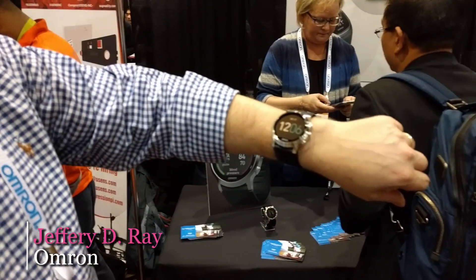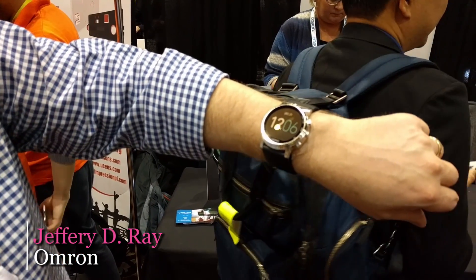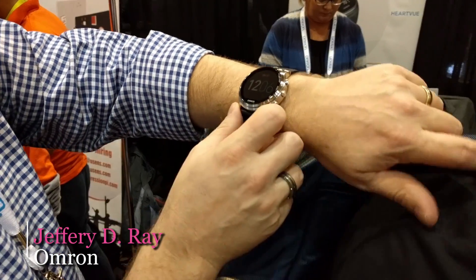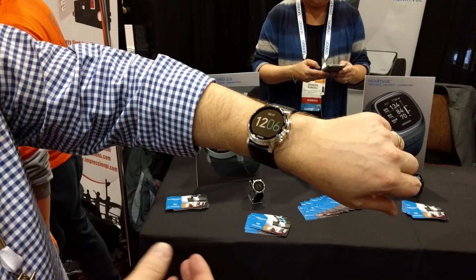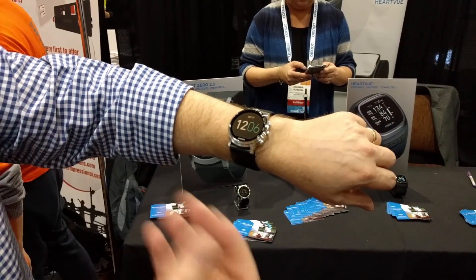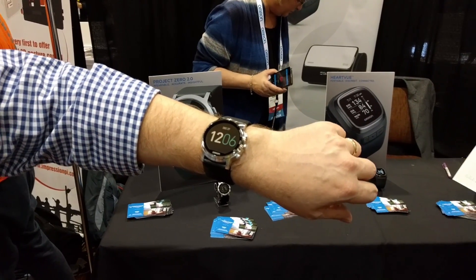Hi, my name is Jeff Ray with Omron Healthcare. Today I'm showing our new Project Zero 2.0 wrist blood pressure monitor. This is the first blood pressure monitor that uses oscillometric technology, which is what the FDA has already cleared and what Omron has been using for over 40 years to build blood pressure monitors.